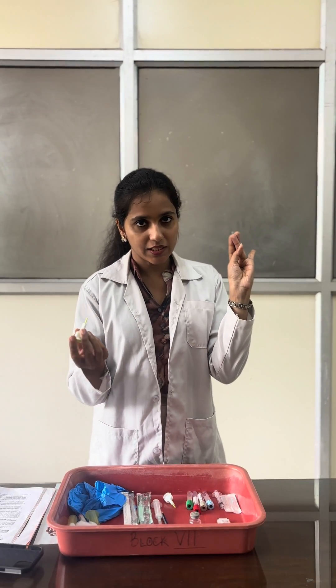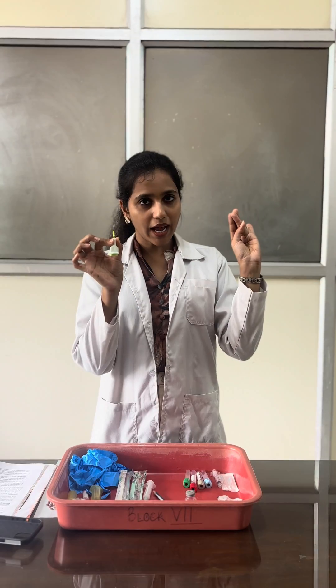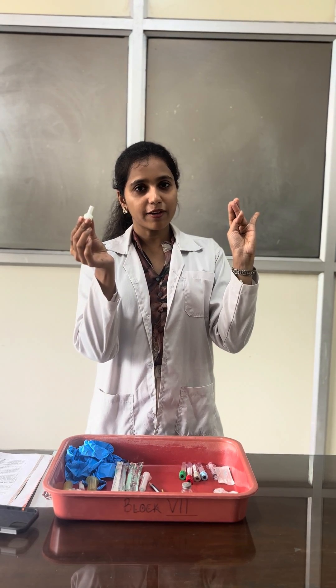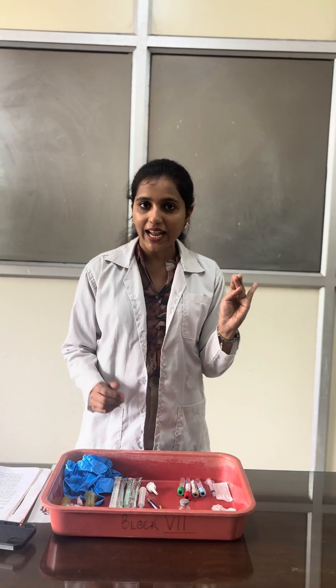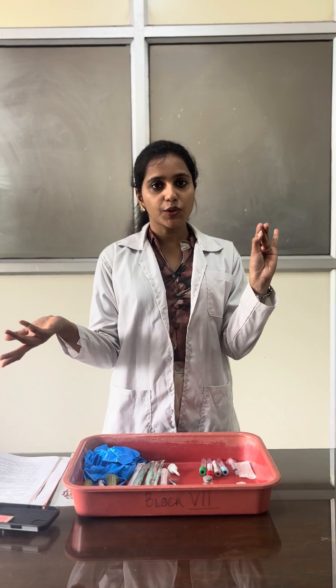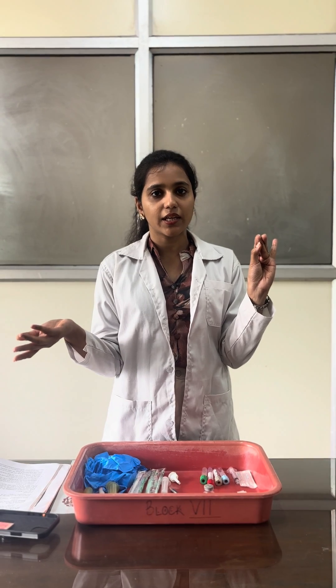Then pick your lancet with your right hand, remove the cap, and give a bold pressure to puncture. Ensure an adequate amount of blood comes. After puncturing the ring finger, discard the first drop because it can have some contamination or fluid. After sufficient blood is formed, collect it for whatever purpose you need — for example, hemoglobin estimation, WBC count, or RBC count.